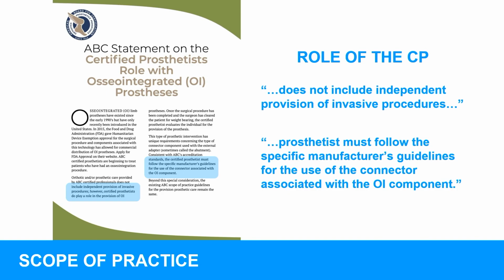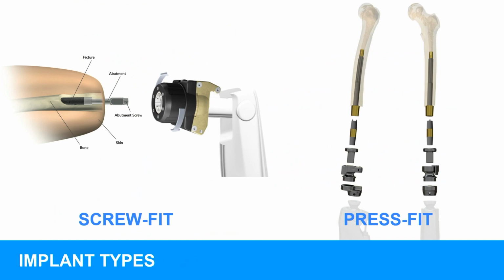ABC made a statement about our role in osseointegration, and osseointegration has been approved for our scope of practice. We are allowed to see osseointegration patients with two minor caveats, and that is, it does not include the independent provision of invasive procedures, and the prosthetist must follow the specific manufacturer's guidelines for the use of the connector associated with the OI component.